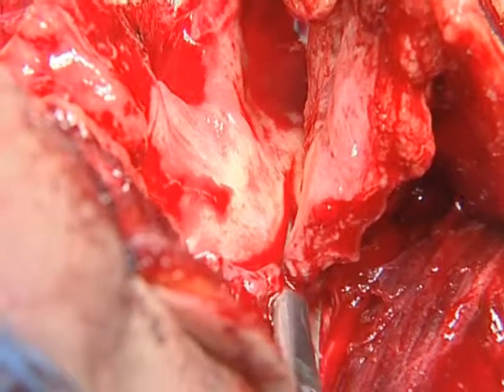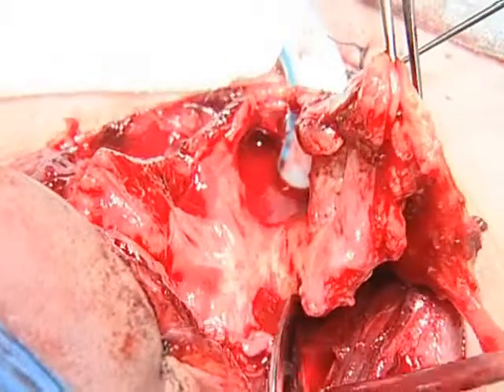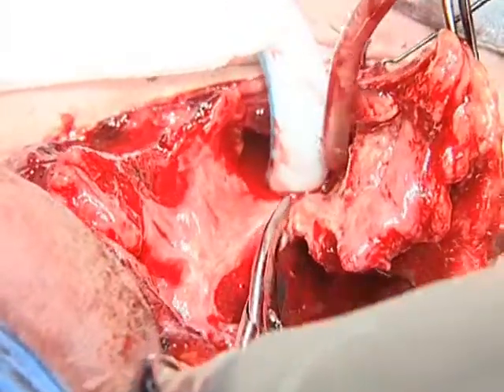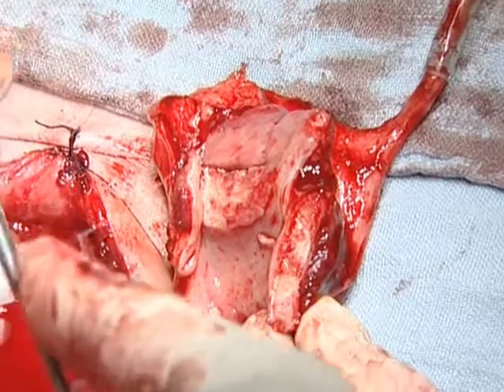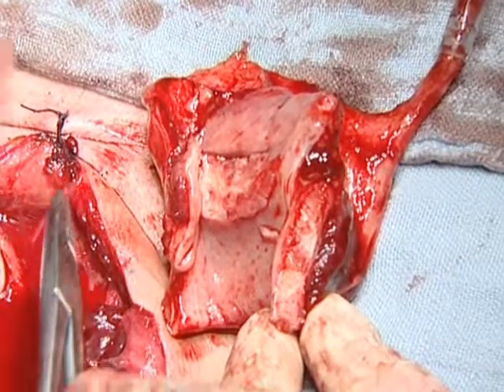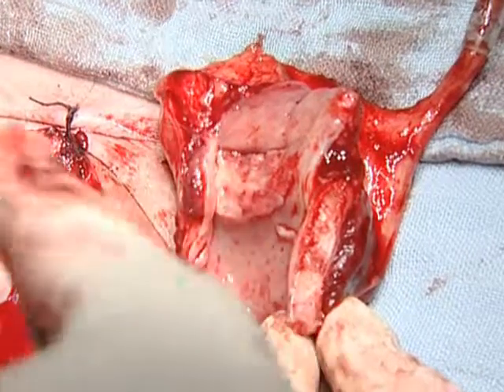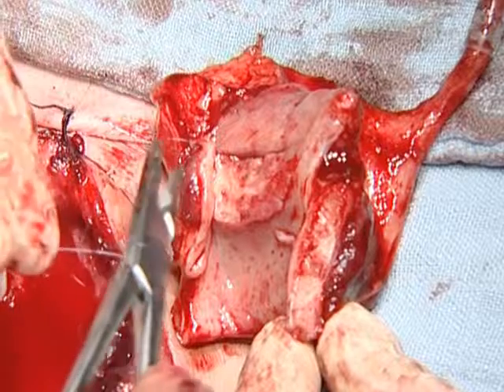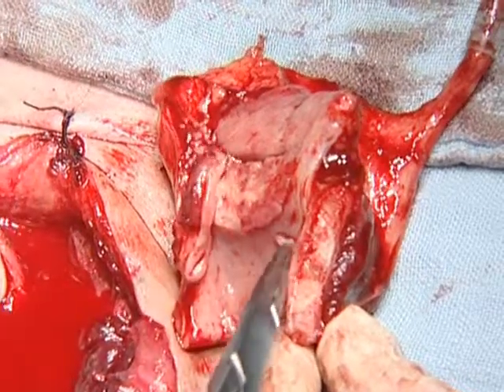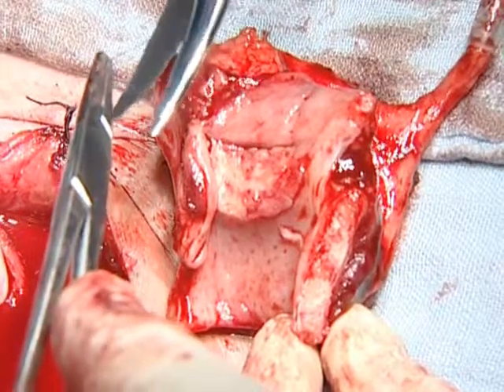The posterior incision is placed in the midline. The tumor extension can be seen on the resection specimen. The subglottic tumor extension can be evaluated. The arytenoid cartilage is included in the resection as well as one centimeter of the contralateral vocal fold.